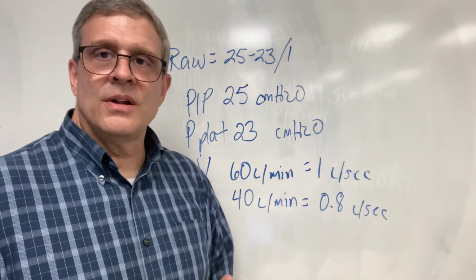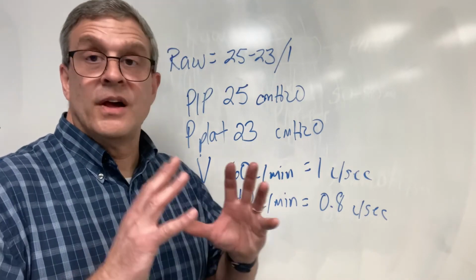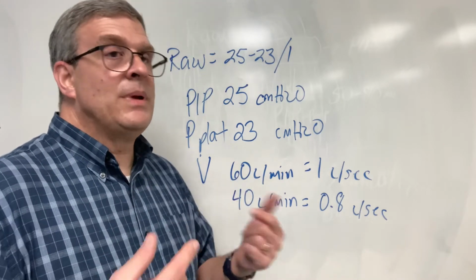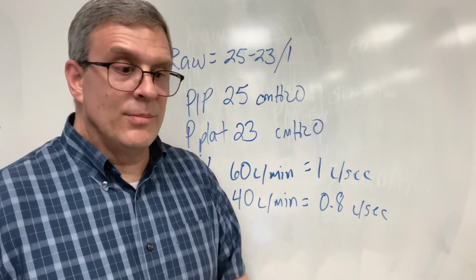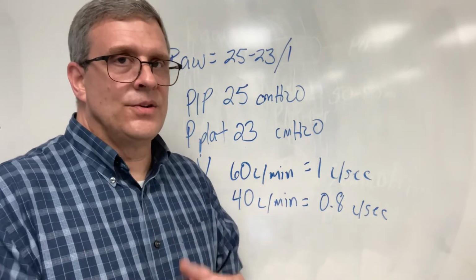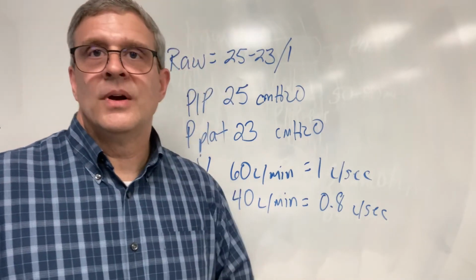Compliance issues are a little different. If the lung is really stiff, non-compliant, then maybe we need to start thinking about changing our mode of ventilation to where we target pressure instead of volume. That's another day. There's another video on that too, by the way, on my YouTube channel.